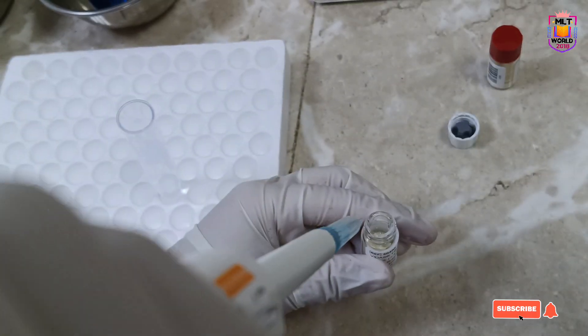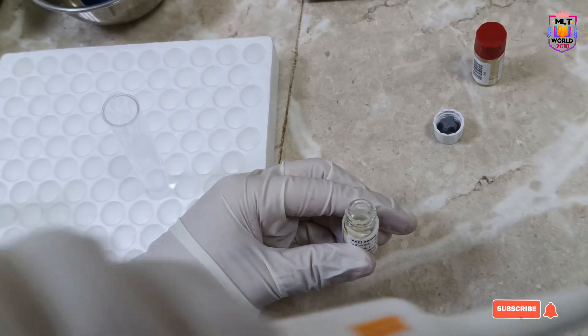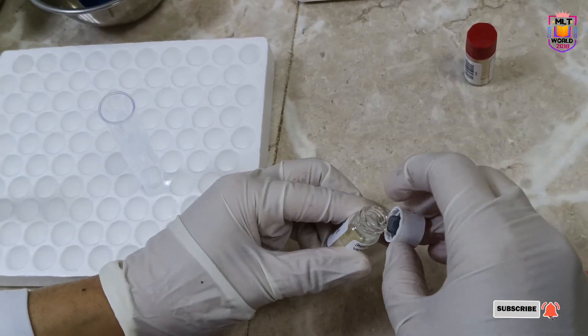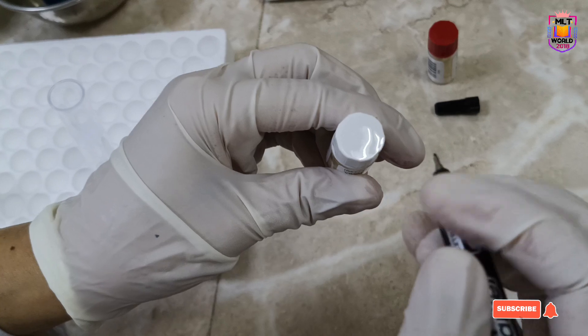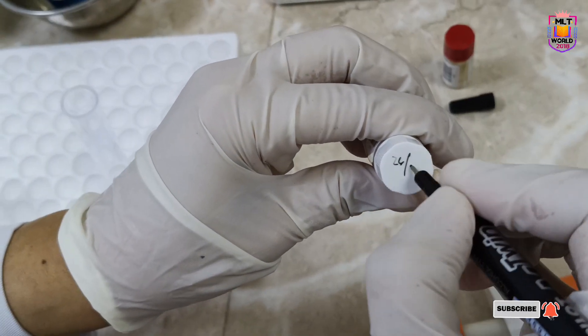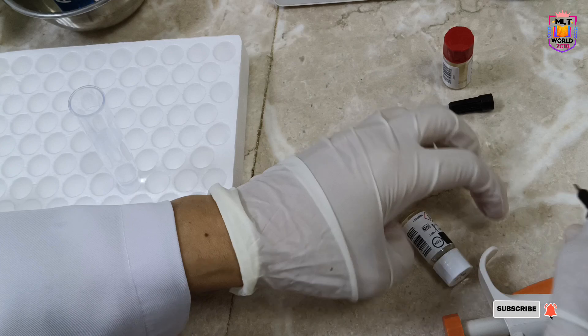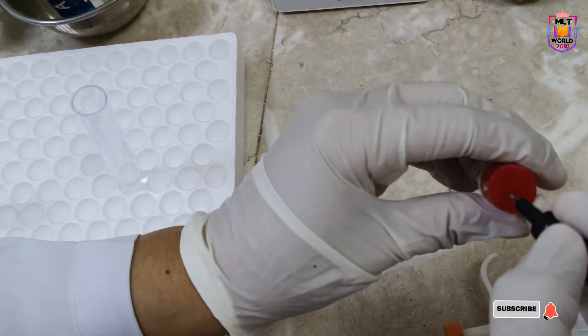Once you confirm that the diluent is mixed properly, then and only then start calibration or control running. Write the date on the vial, because before they were in lyophilized form, and after adding water they are ready to use.